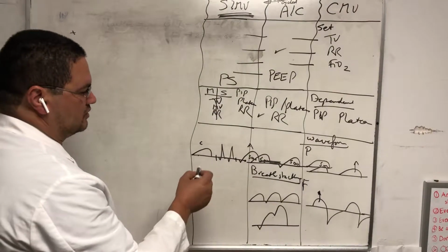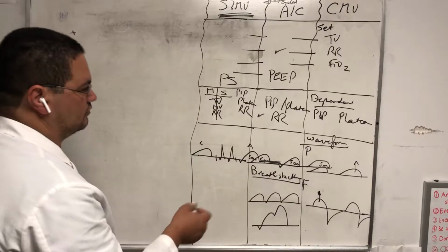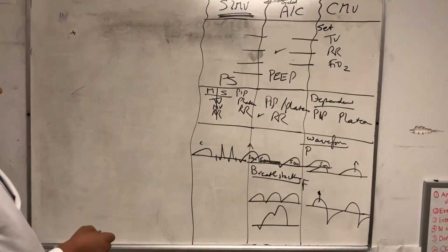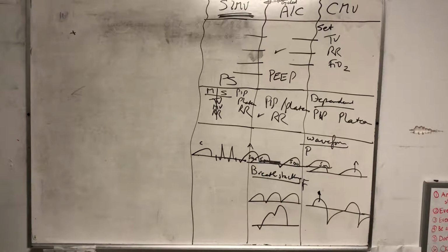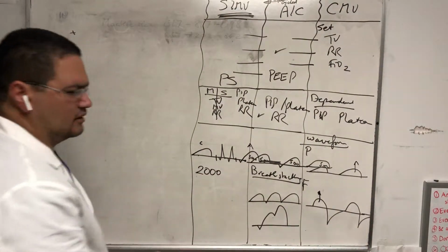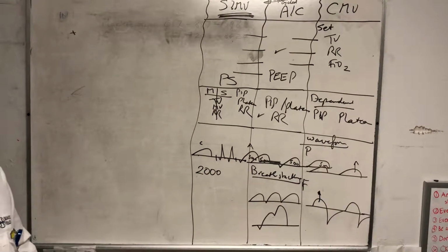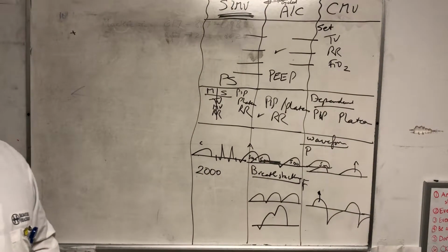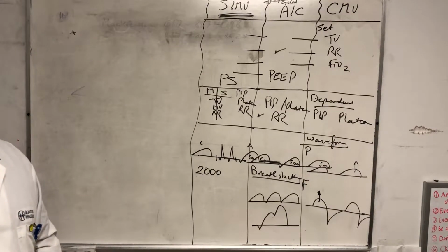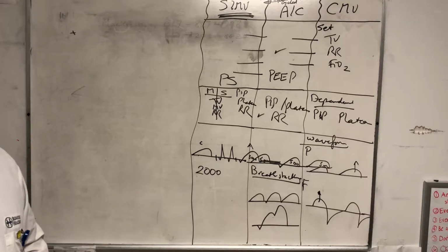So this mode obviously was a revolution. It caused a lot of change. People would decrease the sedation, and the whole ICU, every single ICU was on SIMV until it died in 2000. Not 2000, but the study that killed it came in 2000. But then people continued to use it for another 5-6 years after, and then nobody's using it in acute ICUs except some surgical ICUs.